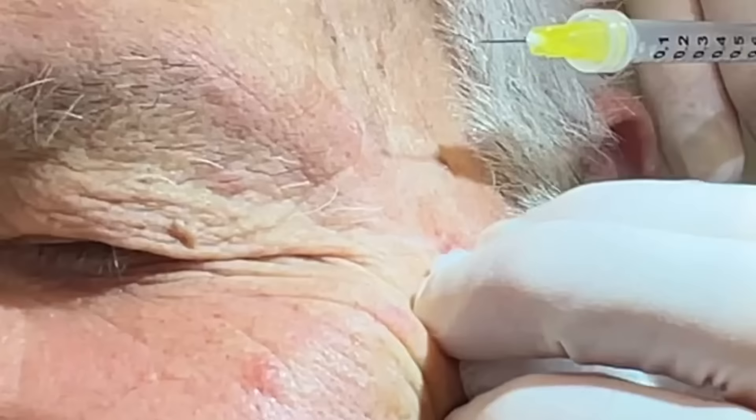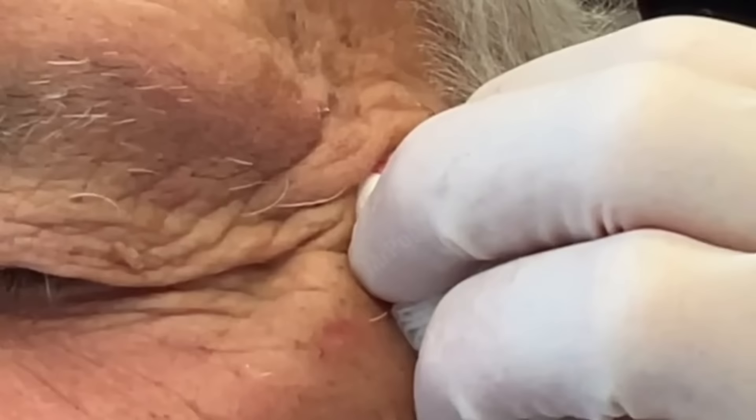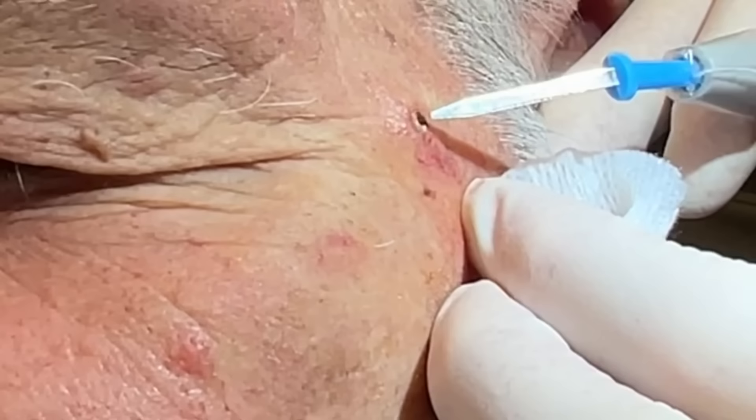Just going to be one little pinch, okay? Famous words, huh? Just to get you numb there. And now I can cauterize that. You'll smell a little burn in there — not too bad. That'll stop that. A lot of times it destroys the little sack underneath there on that cyst too. That looks good.